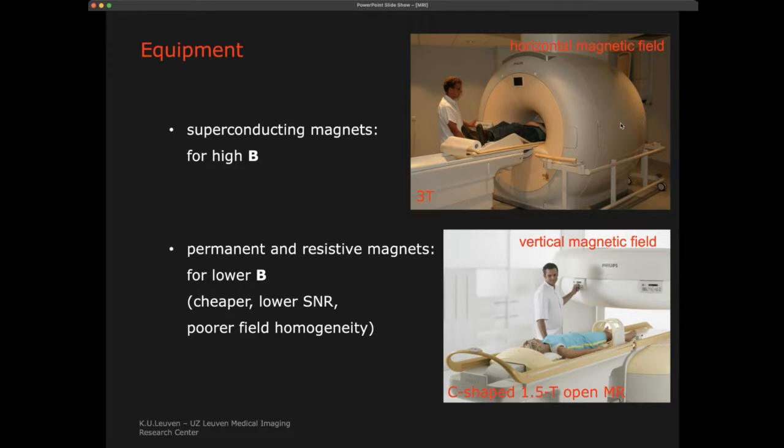But the problem is, of course, our current superconducting materials have to work at very low temperature. Mostly they are at liquid helium, or at least liquid nitrogen, but mostly liquid helium. It is extremely cold that we have to cool this, because otherwise they lose their superconducting capability.